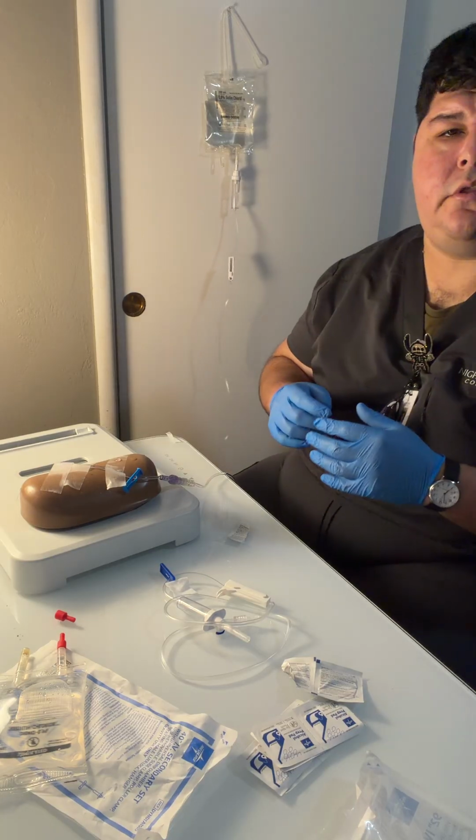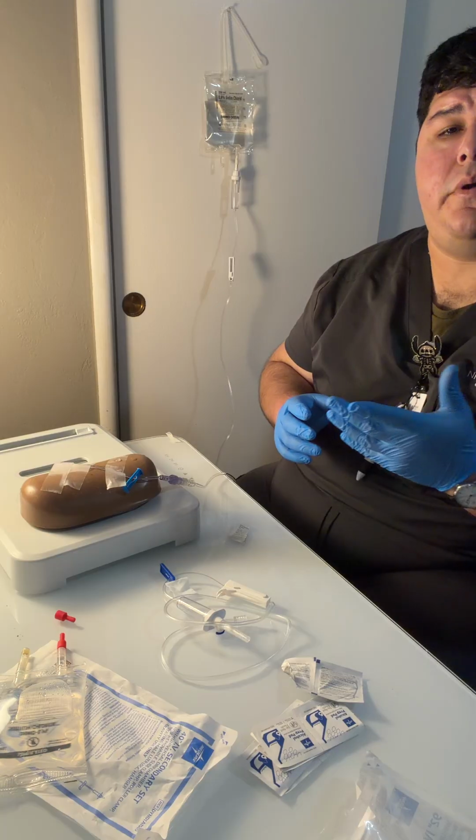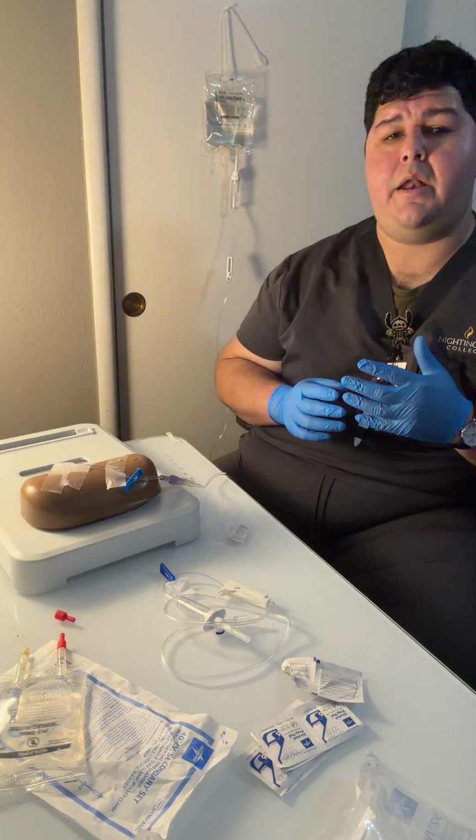And then we will count the whole minute to verify that we have the accurate infusion rate. Okay, so we are at 38 drops a minute.